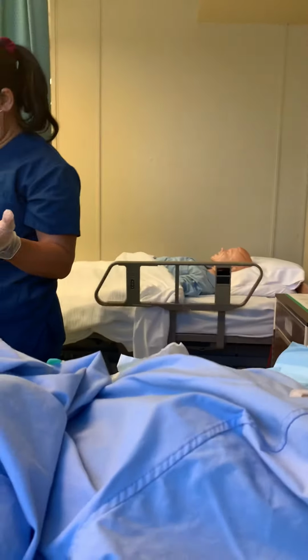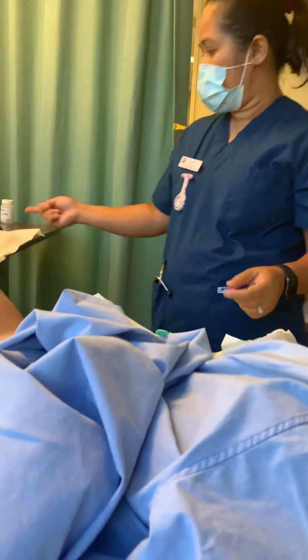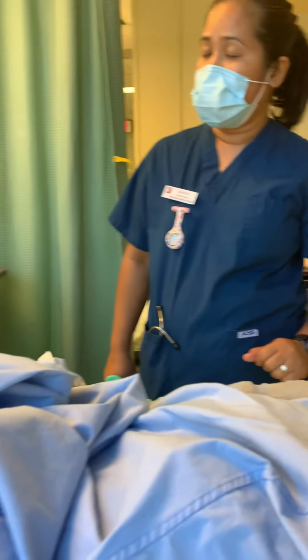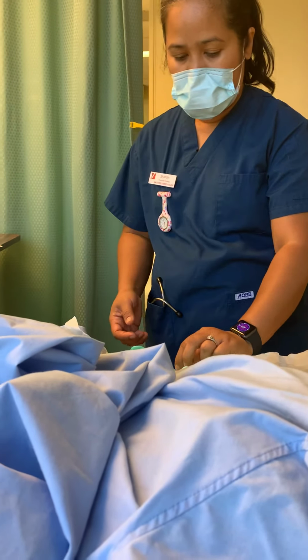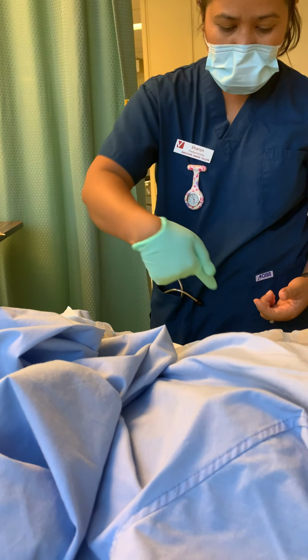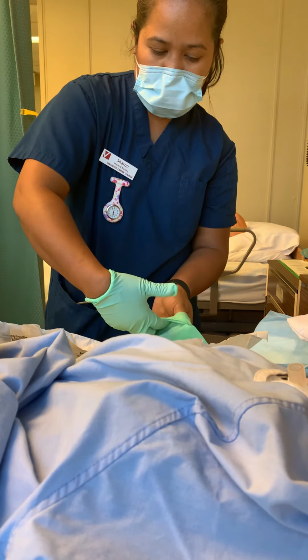Now I can get my gloves ready. When wearing my gloves, I have to start with my non-dominant hand first. Which side did you start, left or right? I used my right hand. Right first, so it's easy later. Be careful with the gloves. Do not touch anything outside of there, and do not touch the skin. You have to do hitchhiking, and then put it inside. Oh shoot.